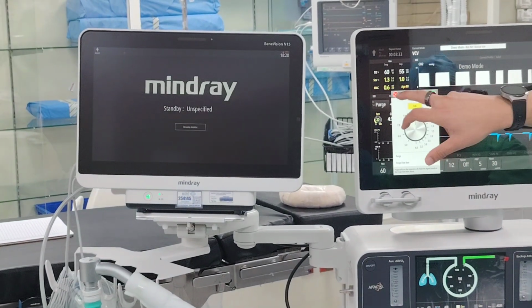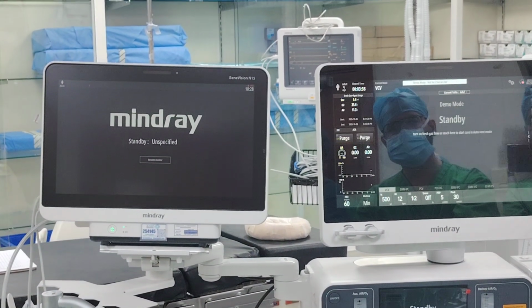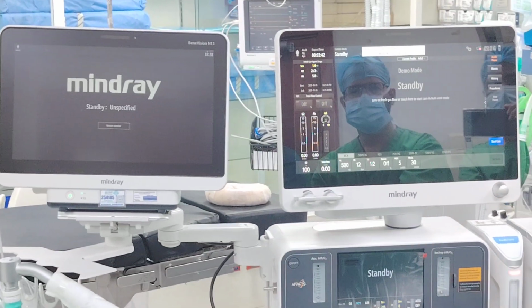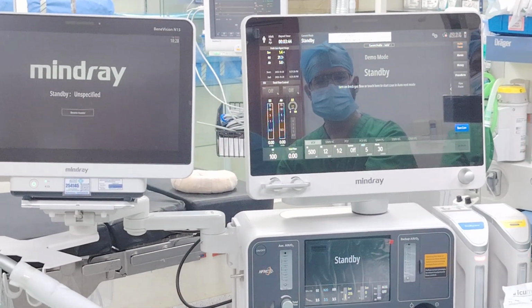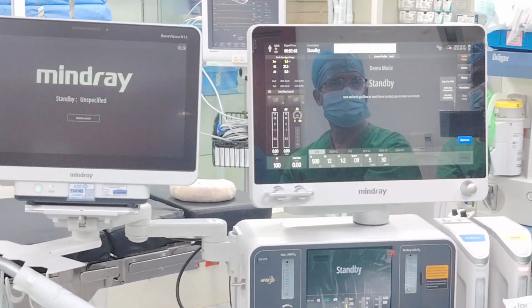Okay? Then in the end, what do you do? Very simple, end case. Voila, that's it. Any questions with the machine? I hope you learned something new. Alright, very straightforward. There are more advanced things, but I don't know how many surgeries you do.